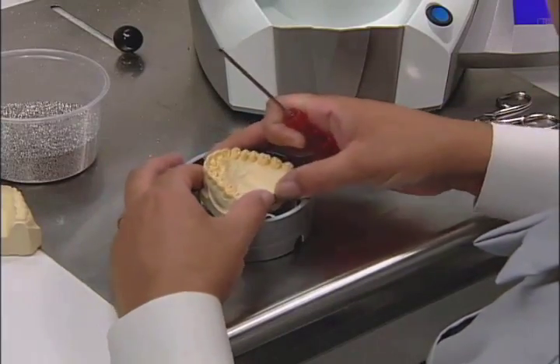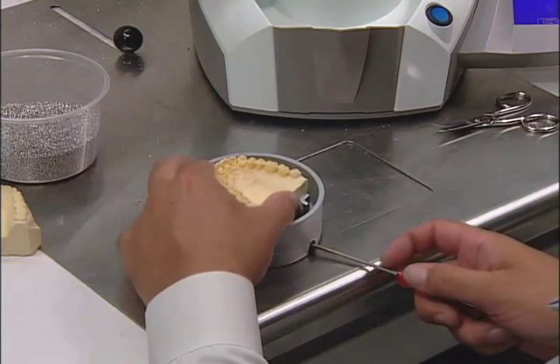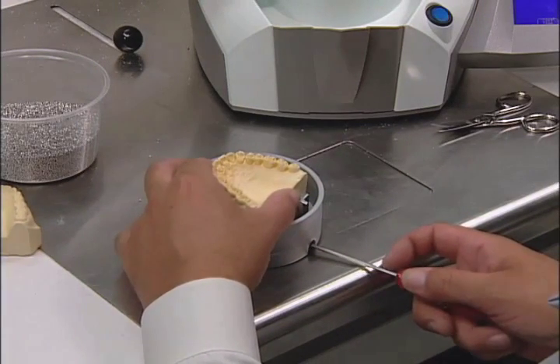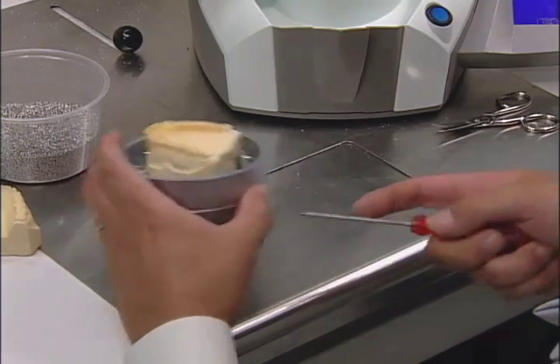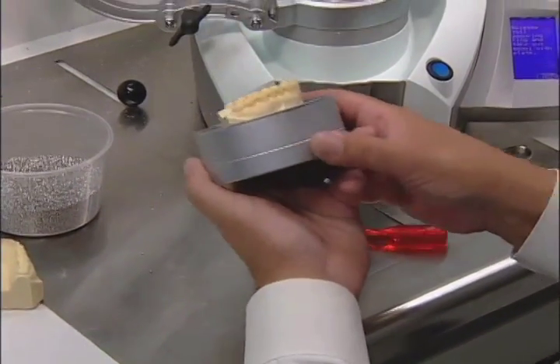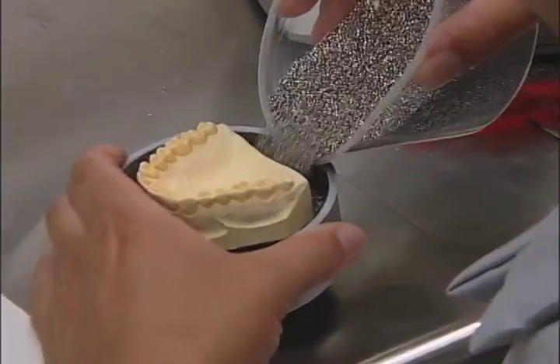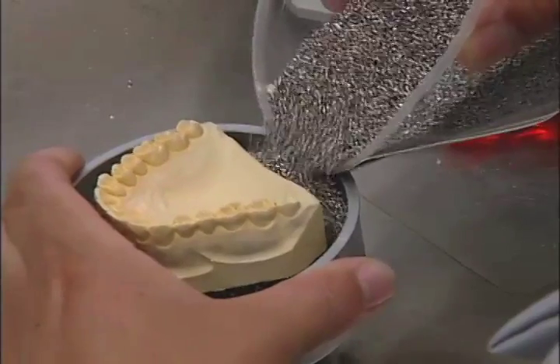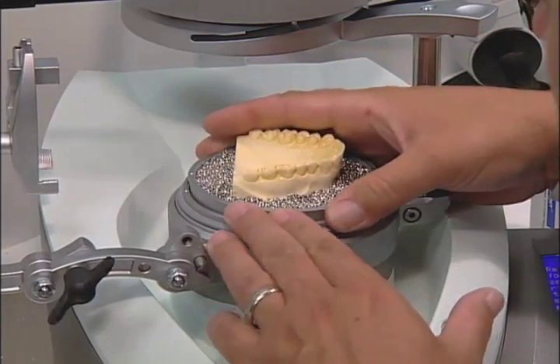Place the model and secure it in the reception pot and fill with granulate. Add the granules and be sure to condense underneath the model. Then place the reception pot back into the thermoforming reservoir.